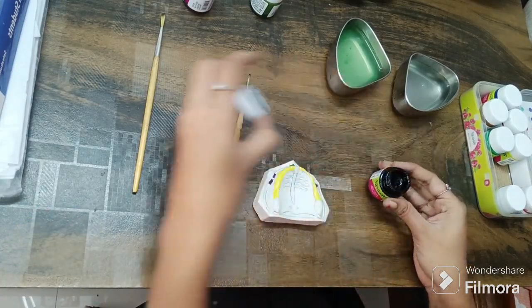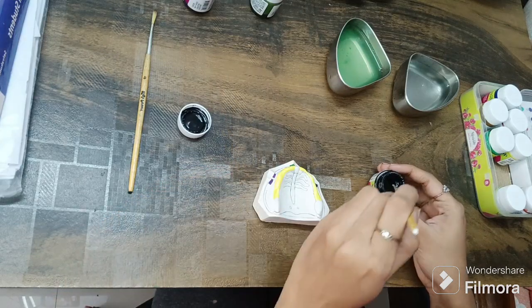For the mid-palatine raphe, I am using black color. This is an acrylic paint.